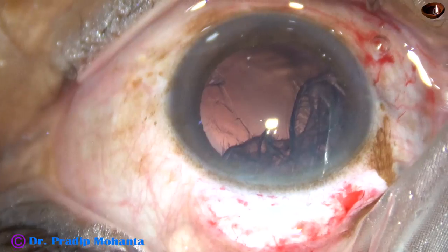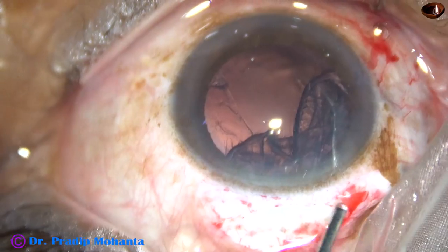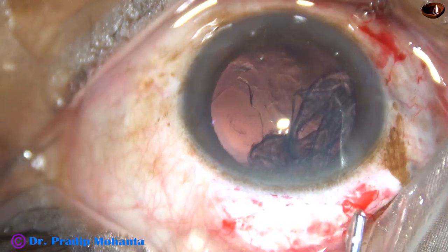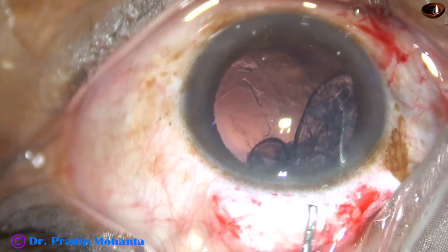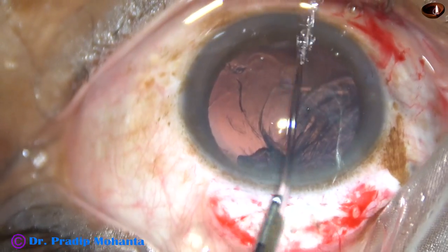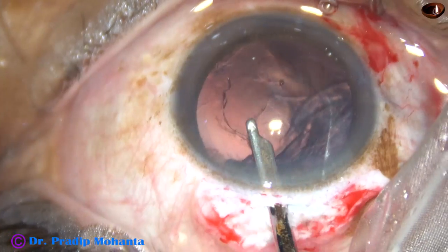Visco is injected into the anterior chamber. Now depressing the posterior leaf — sometimes if we depress the posterior leaf, the epinucleus, if it is free, comes out. But in this case it didn't come out.